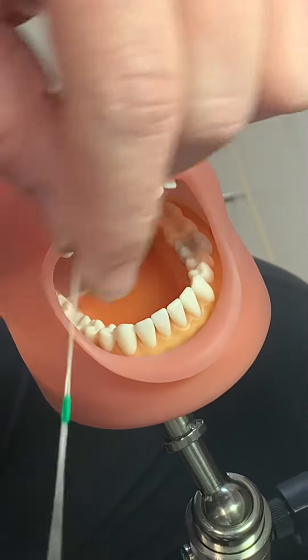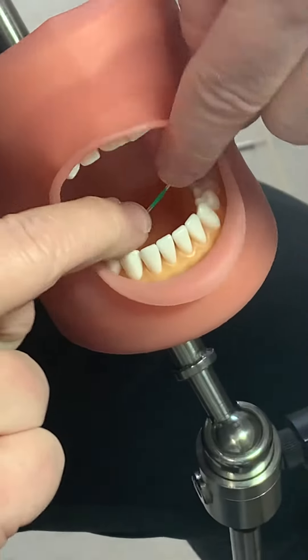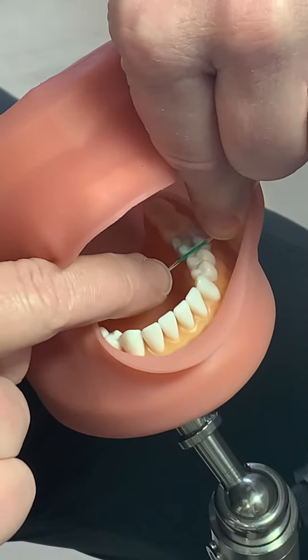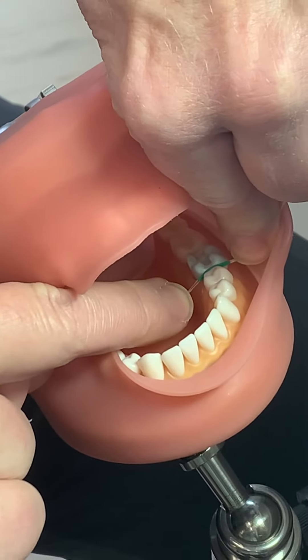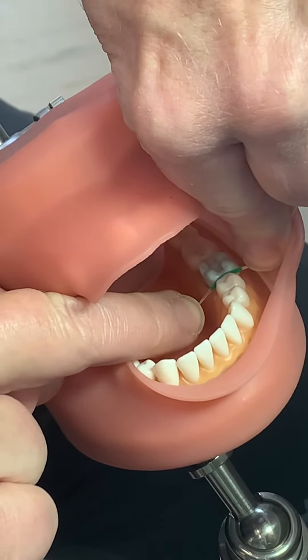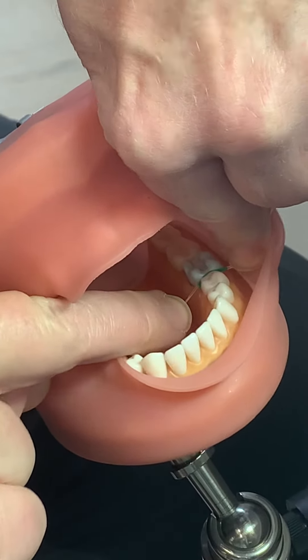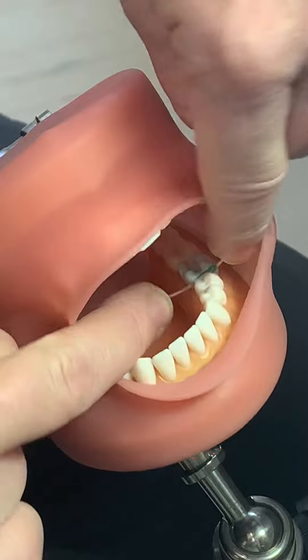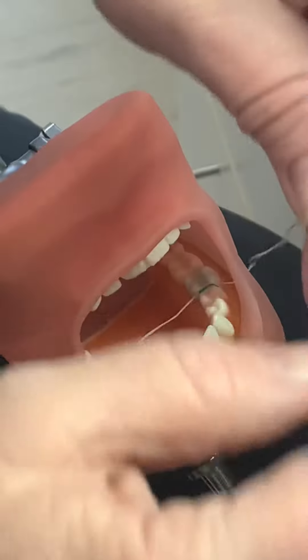The key to this is making sure that you pull it. You're going to go in and kind of floss it down in between those teeth, pull it nice and easy. There we go — it kind of clicked down. Then I'm going to take my floss and pull it out.